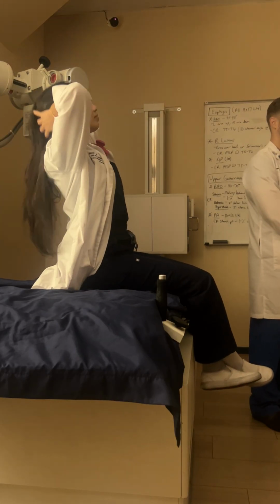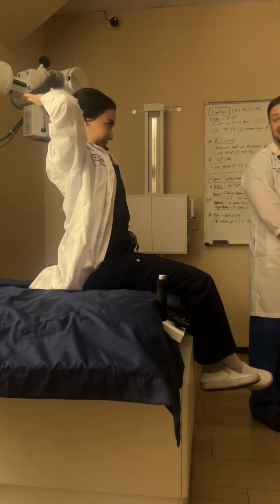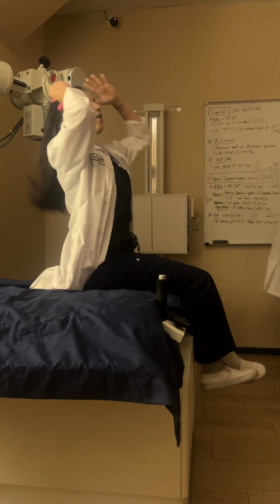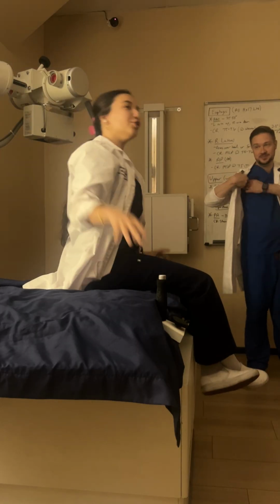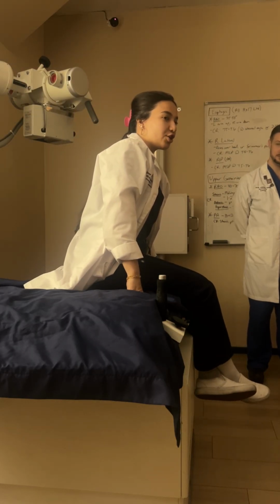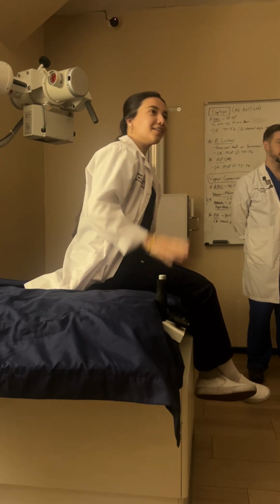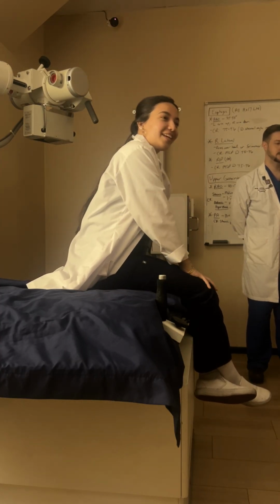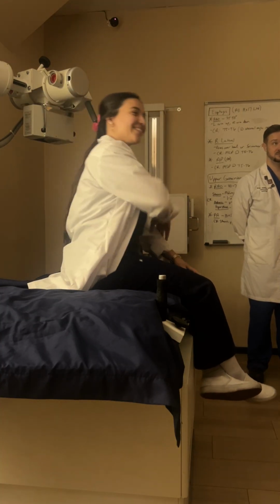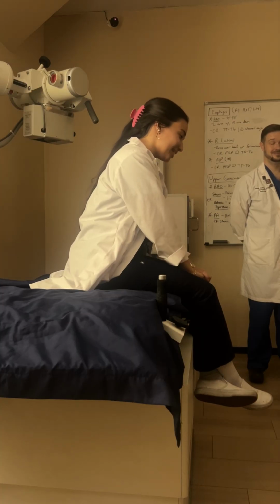Questions? And pediatric enemas are, honestly, I could do a pediatric enema all day. I hate adult enemas. They're messy. So much. The preparation for you, just make sure you are masked up and then put some vapor rub under your nose and you can last all day. Take a breath every once in a while. Open the door. Close the door. Because it can get stinky in there.